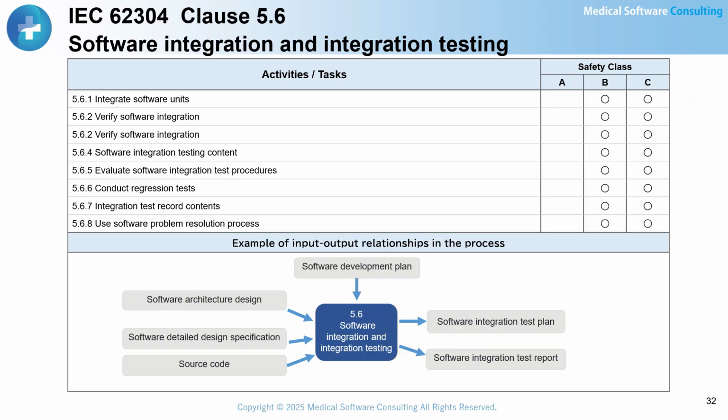In software integration testing, the following points should be considered: clearly defined and documented in the software test plan, the required functions of the software, implementation of risk control measures, specified timing and other behaviors, the functions of internal and external interfaces, tests under abnormal conditions, including foreseeable misuse.